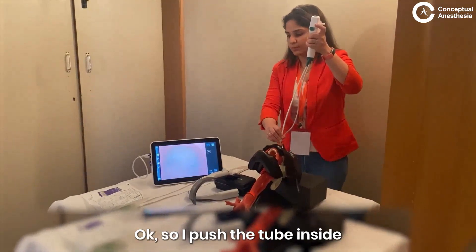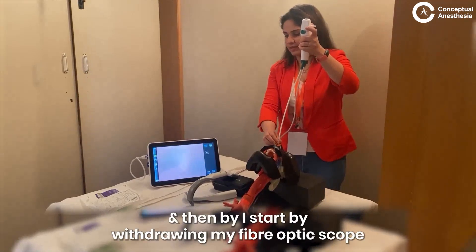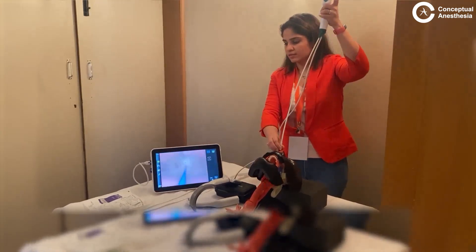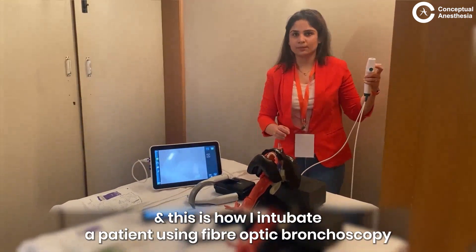I leave the scope here right above the carina and now I start loading in my tube. I push the tube inside and then I start withdrawing my fiber optic scope. You can see the blue line while coming out. And this is how I intubate a patient using a fiber optic bronchoscope.